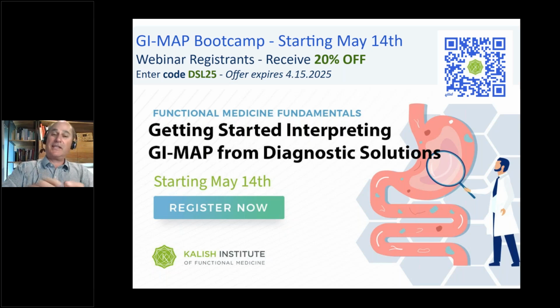What she means is the GI map is a PCR test. It's quantitative. It's not a yes or no, but they're looking for the DNA and they amplify it, and they have to get to a certain number to officially diagnose H. pylori. But sometimes you're going to see H. pylori present, but not above the reference range, so there's no red H there. It won't say high, but it's there. What do you do in that case? It's a hard one.